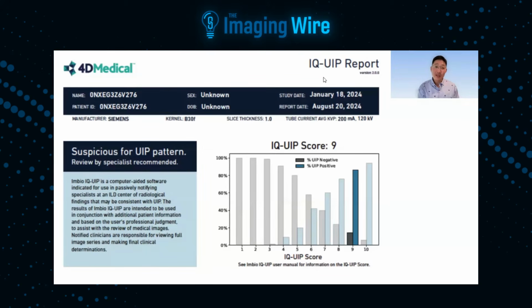Now you should really think about it, maybe look over the CT scan again and try to make the best diagnosis for that patient. It seems to me like this score and this tool would be really helpful for, like you mentioned earlier, community radiologists who have to deal with a lot of different conditions coming in and maybe don't have the really deep experience that a thoracic radiologist like yourself might have.